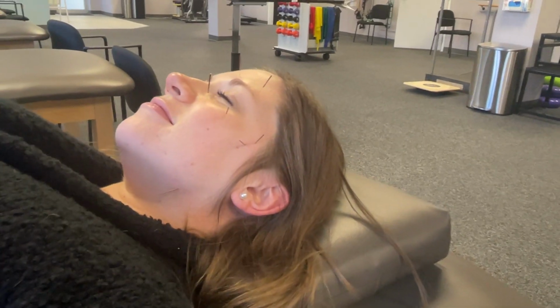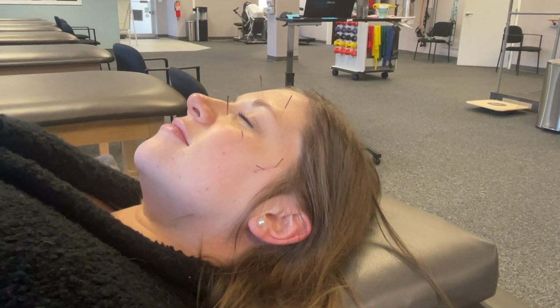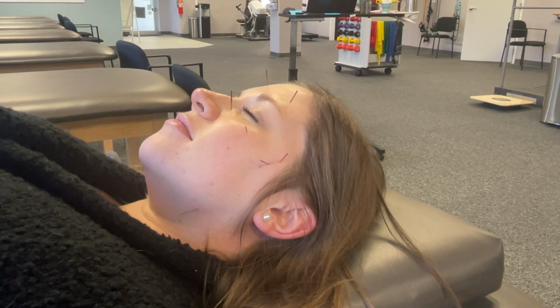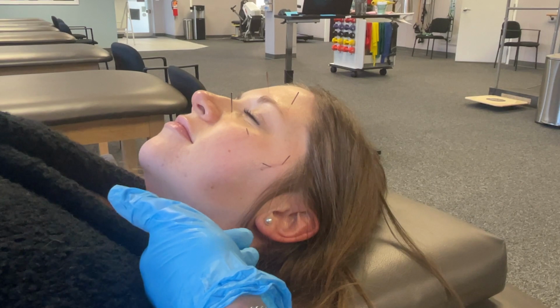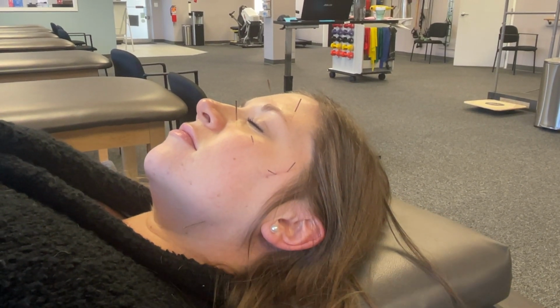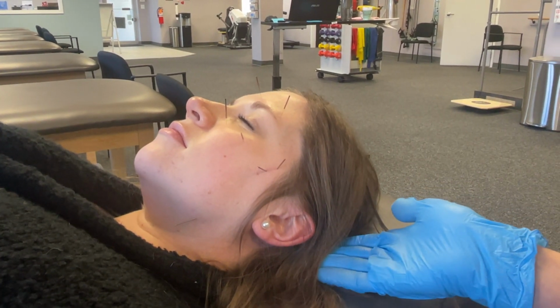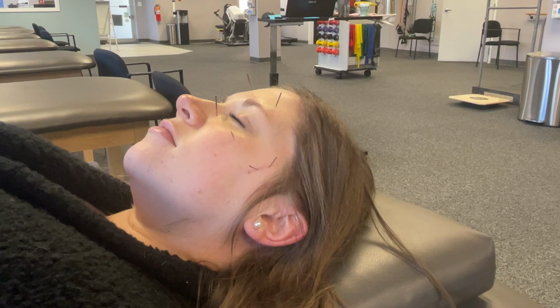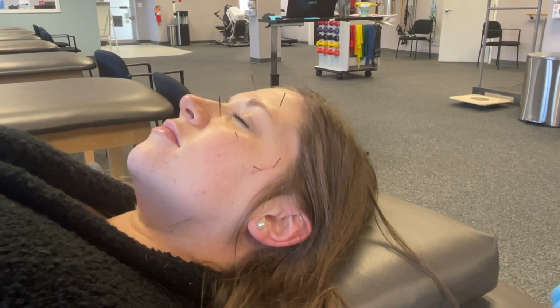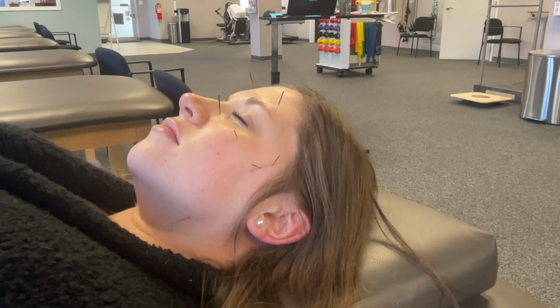So some other common needle insertion points for people with TMJ dysfunction, and again, it all depends on that patient's specific symptoms. We could insert along her sternocleidomastoid muscle, which, if that were to be tight, would pull her into more of a forward head posture, creating some more tension on the posterior aspect of her head and neck, further creating headaches. And same with why we would place those needles in the base of her skull and back of her neck as well.